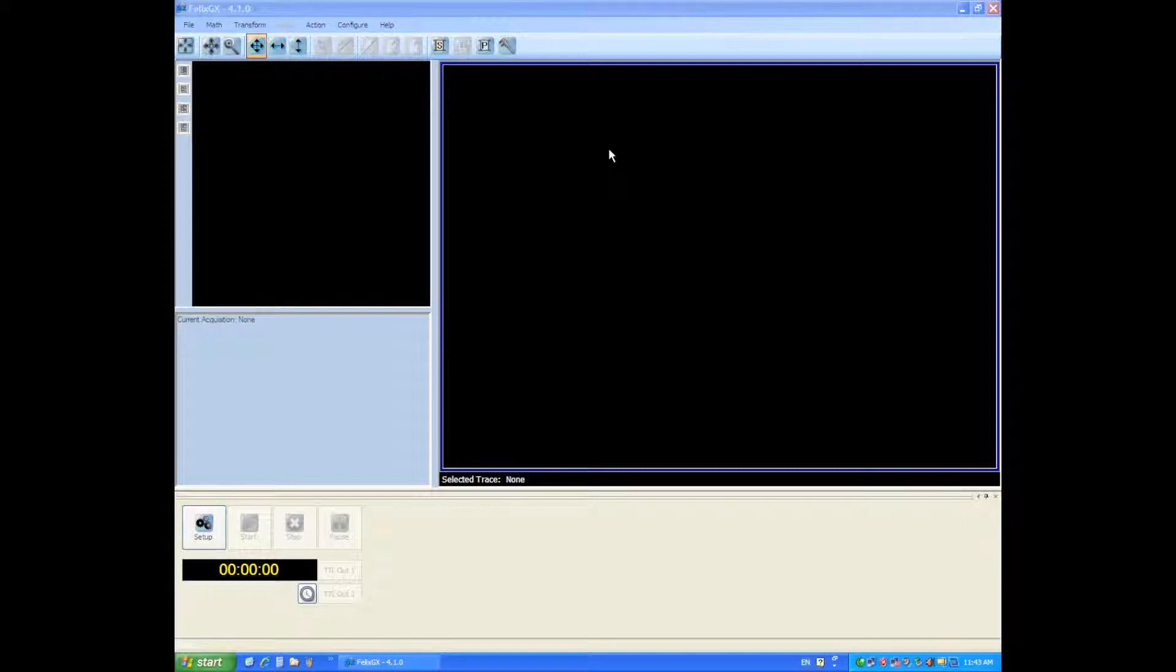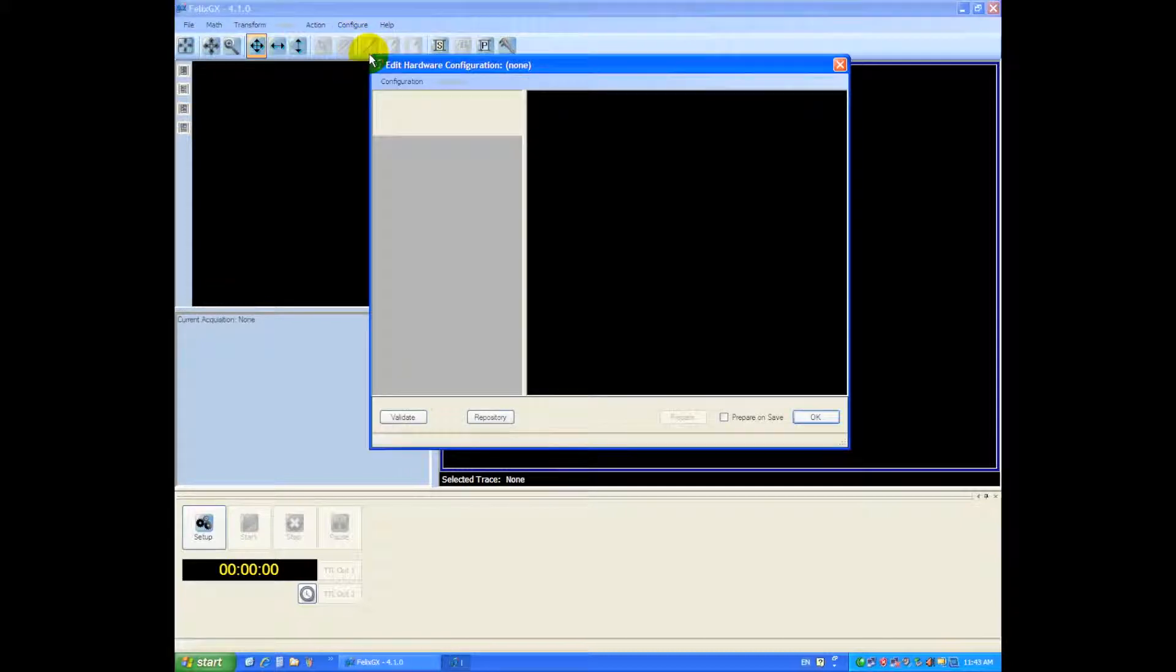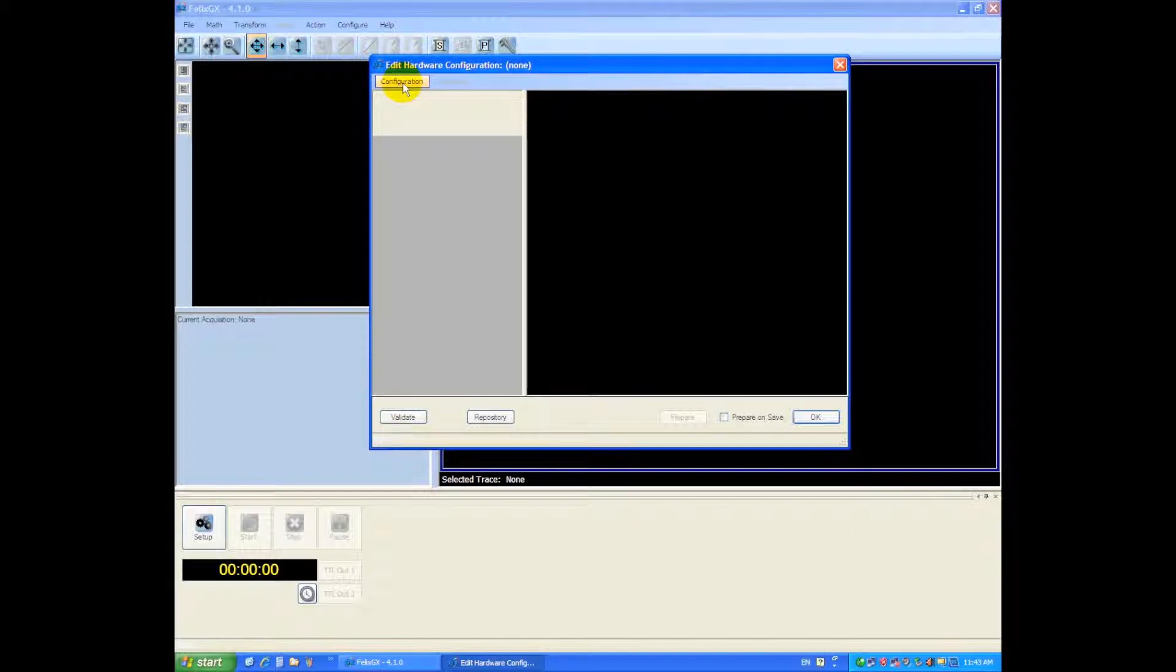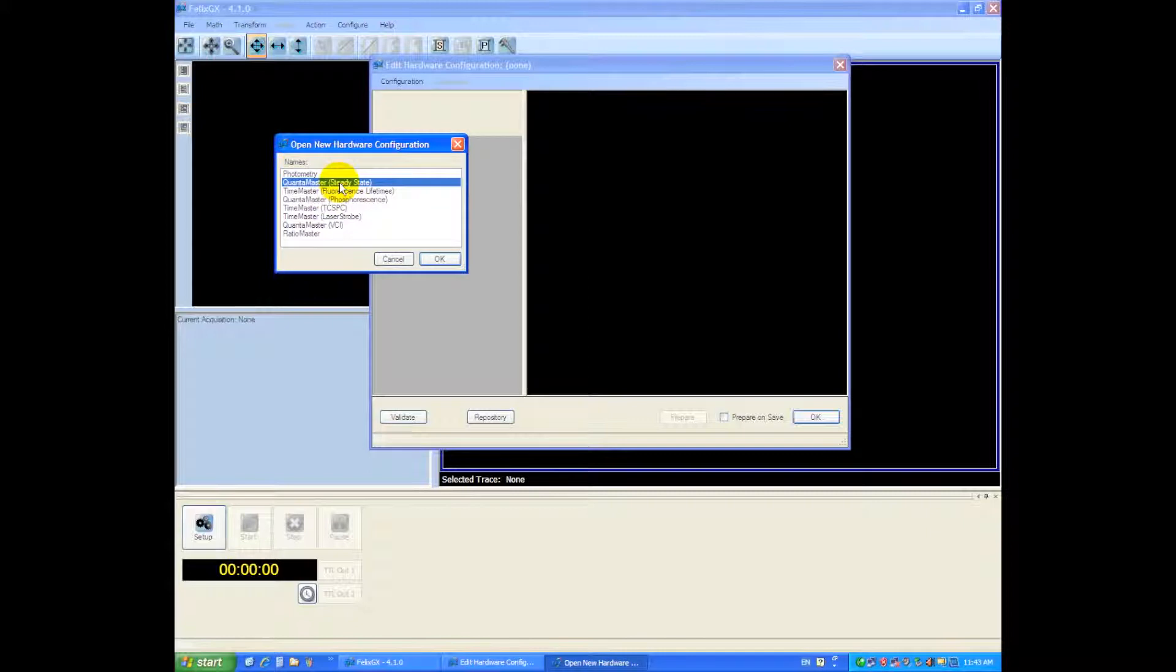First thing you want to do once launching Felix 4.1 is to go to the configure menu and choose hardware. There will be a blank hardware configuration and what you want to do is build a configuration by saying new and we're going to choose a steady-state quantum master which is a QM40 instrument.